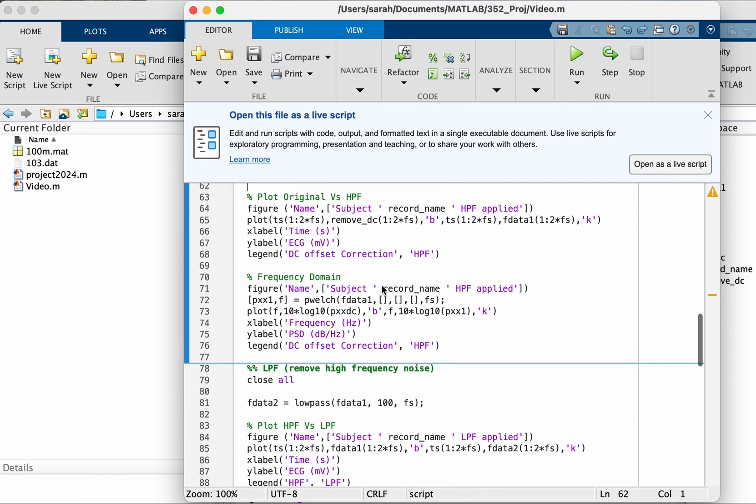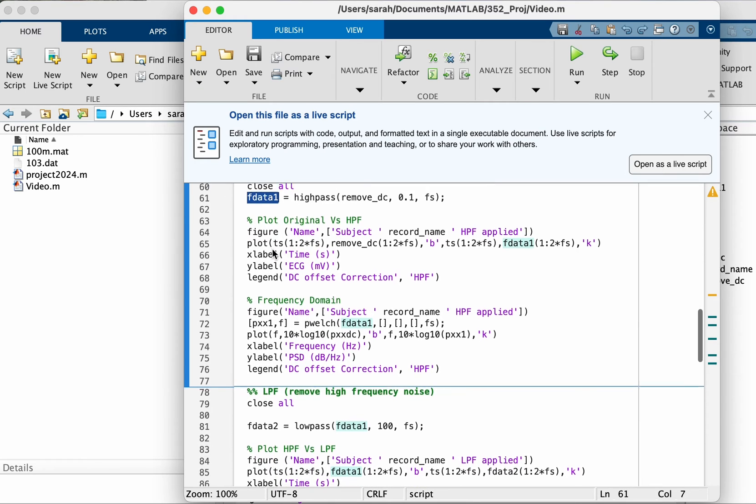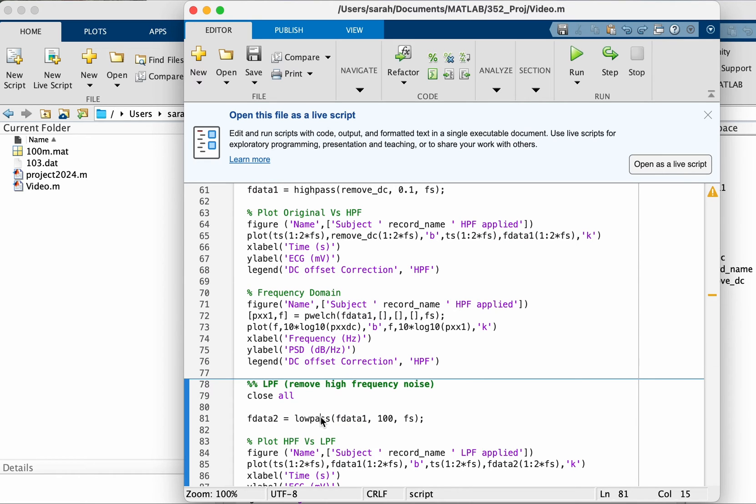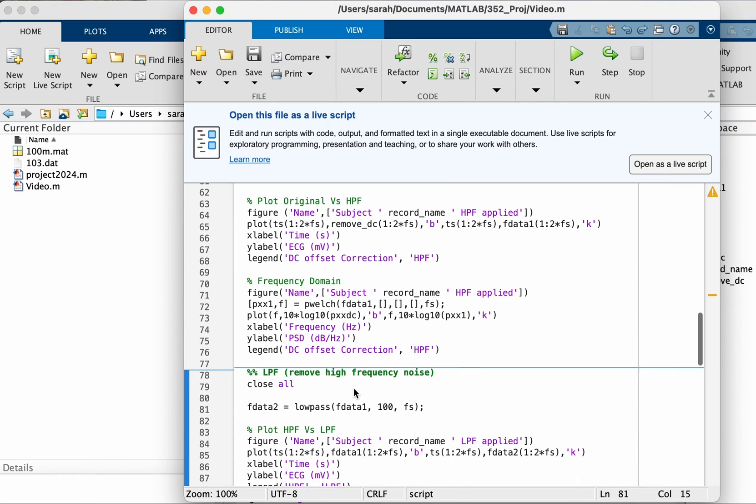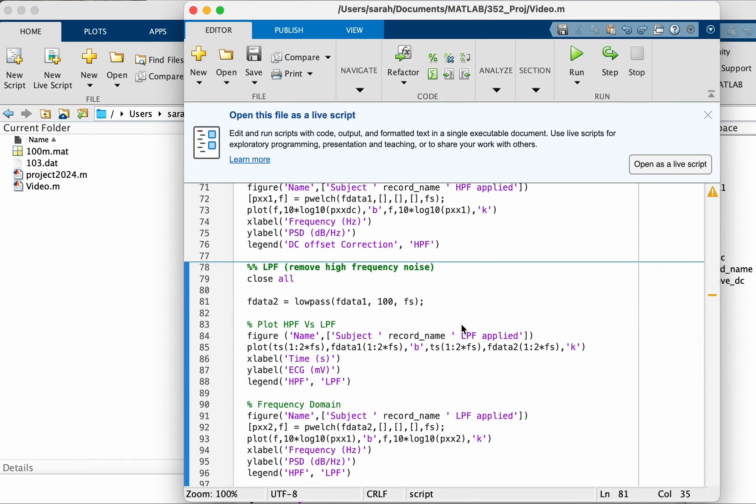So the output here of the high pass filter is the signal f_data_1. Now we're going to take this f_data_1 and apply a low pass filter to remove the higher frequency noise. Let's see the before and after.